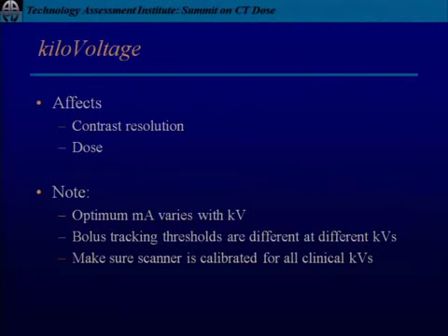A few things to be aware of, and this, I believe, is a whole separate section later on in the summit, so I'm not going to go into any of this in a lot of detail, but just to note it here: if you do change your kVs, you will need to change your mA. There's a different relationship with that, and if you use a different kV, you will need to use a different mA, a different technique.